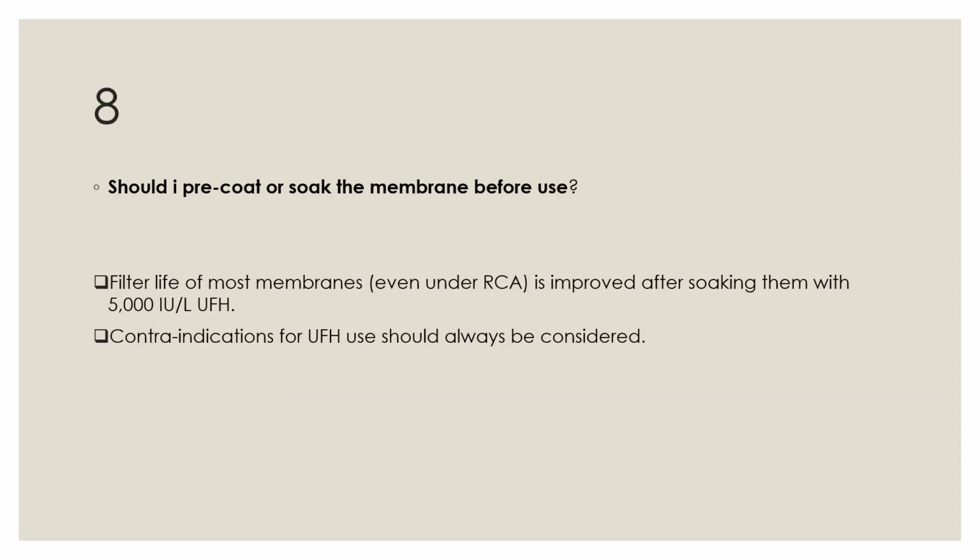Should I pre-coat or soak the filter membrane before use? The filter life of most membranes, even while using regional citrate anticoagulation, is improved after soaking them with 5000 international units per liter of unfractionated heparin. The contraindication for unfractionated heparin use should always be considered.